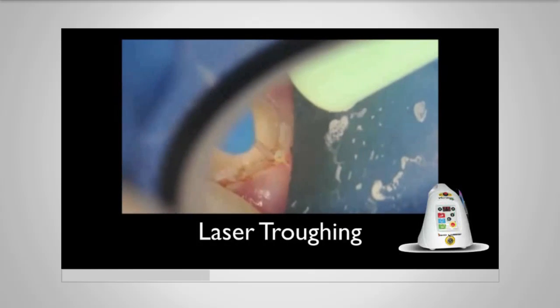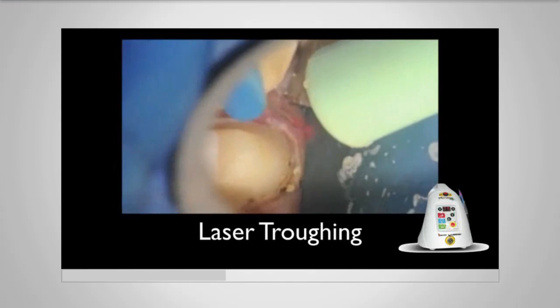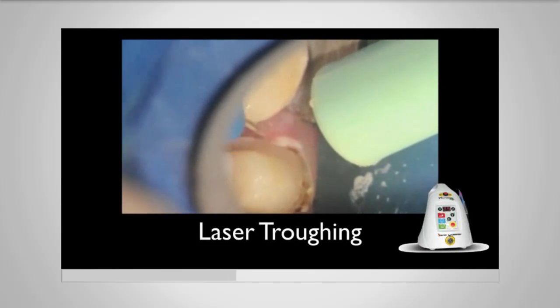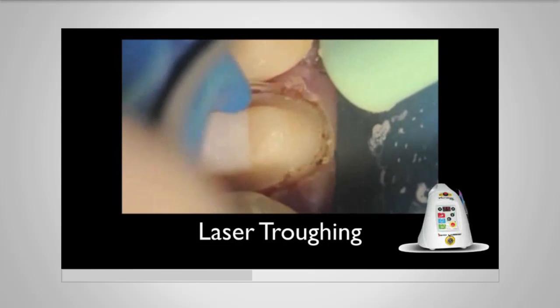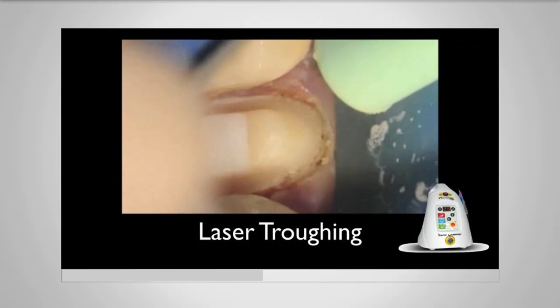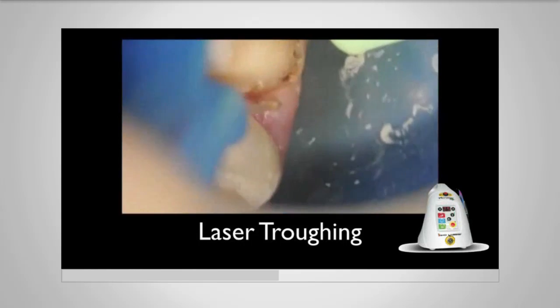As you see Dr. Van Ass go around, he's removing this tissue very conservatively, and is not charring it. We're not seeing any significant black or brown marks. The laser energy is appropriate. And we'll get a nice open sulcus all the way around the preparation. Once that's completed, there'll be some tissue tags that are present, and you can just take a little bit of hydrogen peroxide and a dental infuser tip and go ahead and clean that area off before drying the sulcus and capturing your final impression.